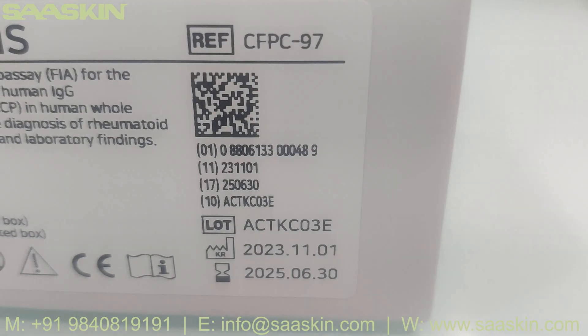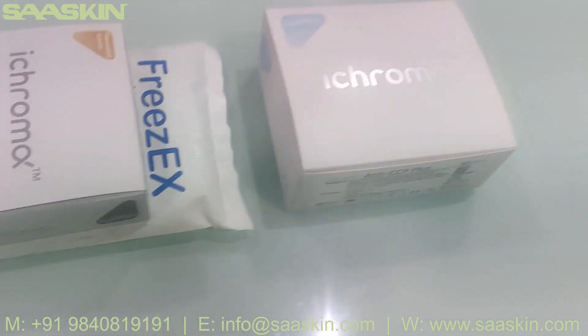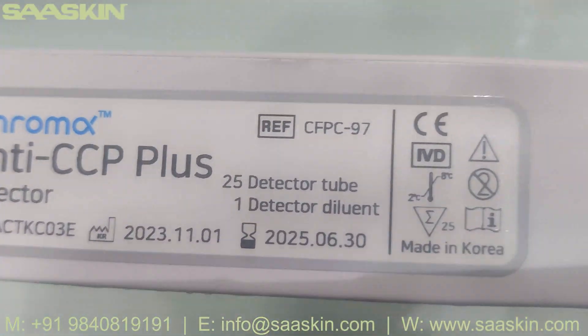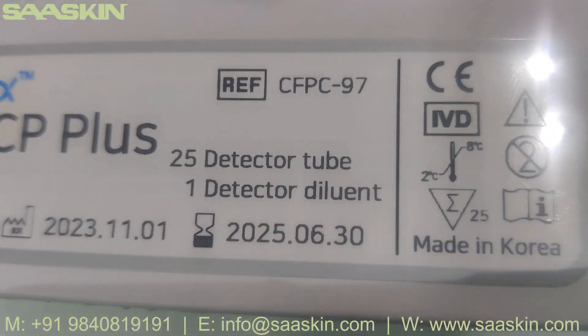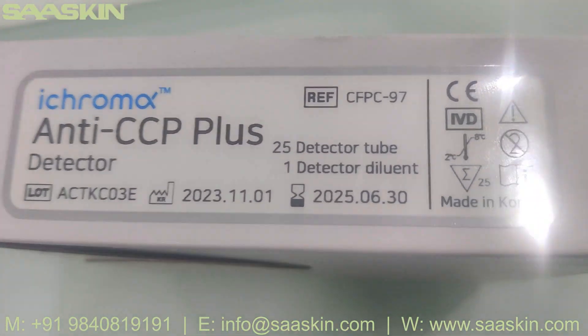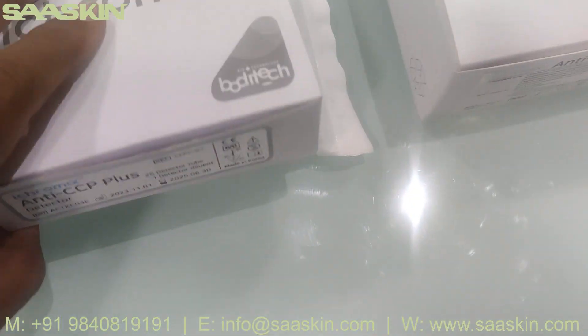On the standard packaging, you have two years of expiry. You can see the reference part number, and this kit also has reagents that come along with it, which have to be maintained at two to eight degrees Celsius. This other box has 25 reaction tubes and one detector diluent.